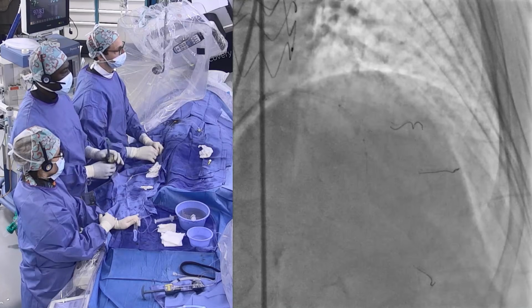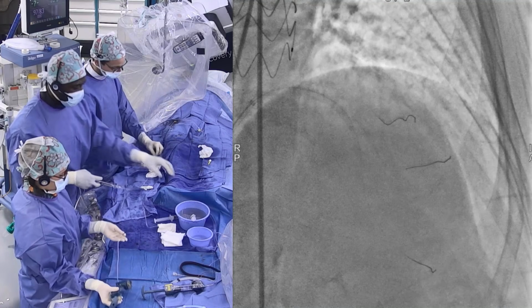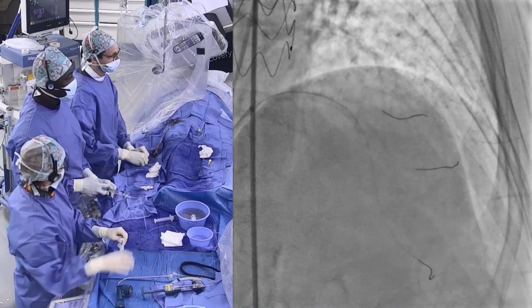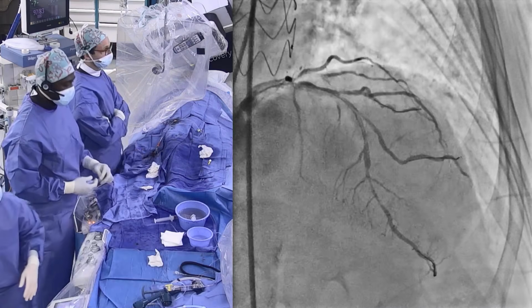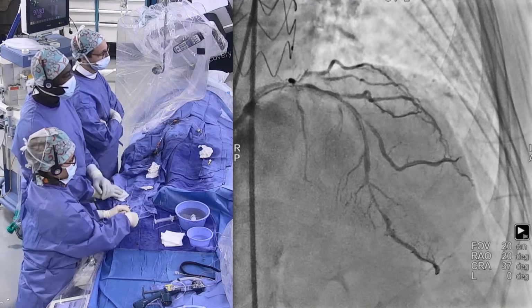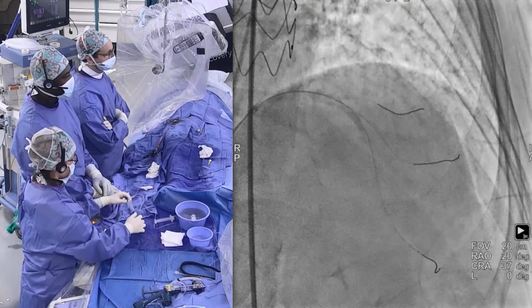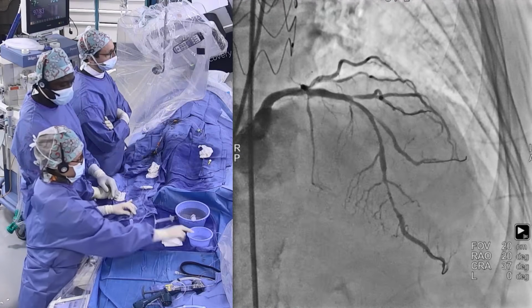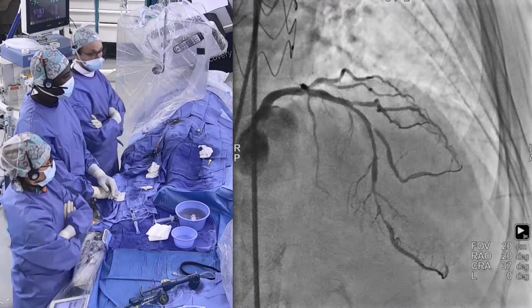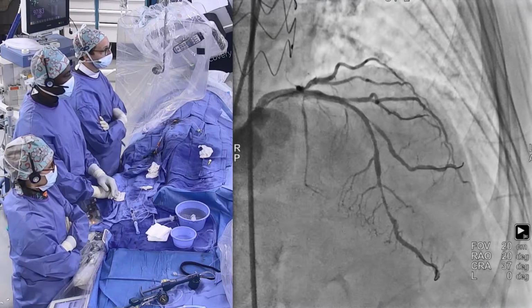So this was 20, just in terms of length, but we have the IVUS as well to tell us what is the length from a lesion-free zone distally to a lesion-free zone more proximal. Okay, you can appreciate that there is a slow flow in the diagonal, in the second diagonal. There is still the spasm on the distal LAD. Maybe we should prepare the ostium as well. For sure, this is a huge diagonal. The risk of losing it when we implant the stent is high, so maybe we're going to protect this ostium. Okay? Do you agree, guys?